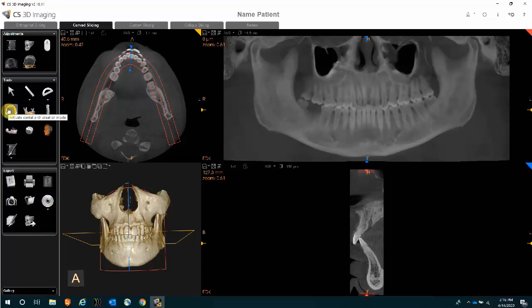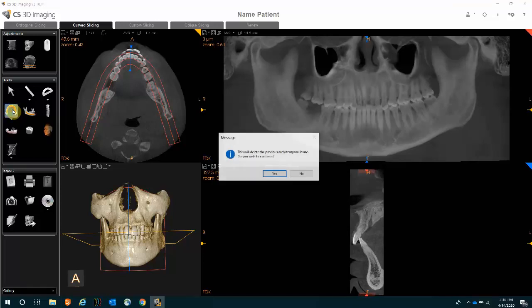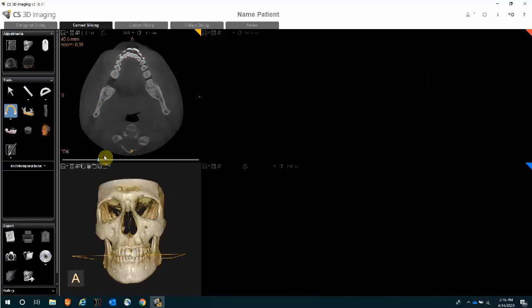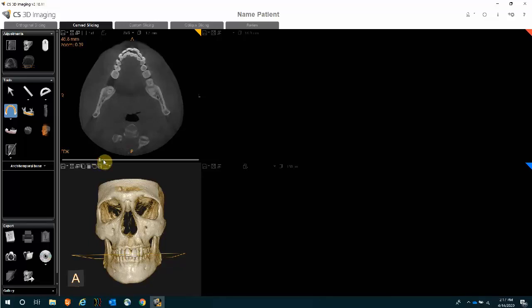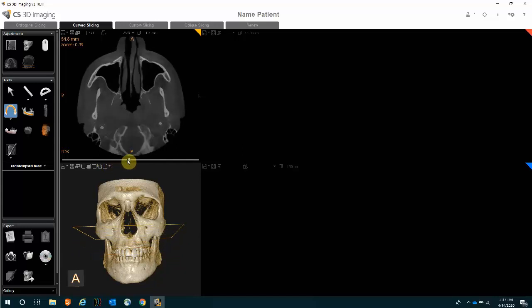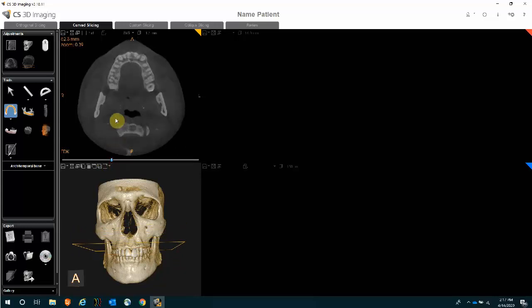It is also advisable to create your own arch. In the tool section, there's an option to activate the dental arch creation mode. If you select that option, a message will appear asking if you would like to delete the existing arch — go ahead and click Yes. Depending on the area where you're placing your implant, if working in the upper arch, use the slider bar at the bottom of the axial presentation to move into the upper arch, so your panoramic view will be more reflective of the upper arch.